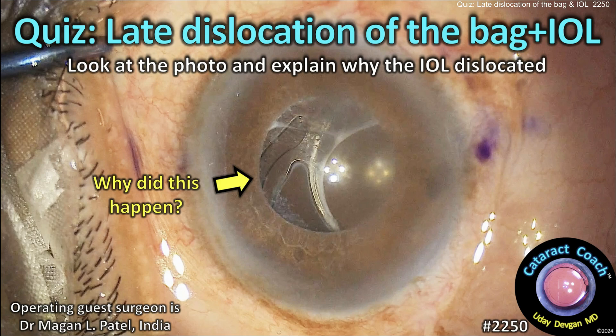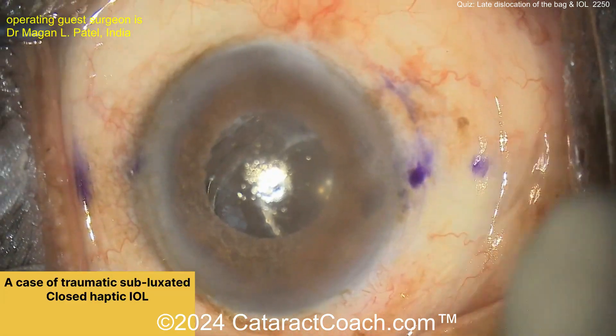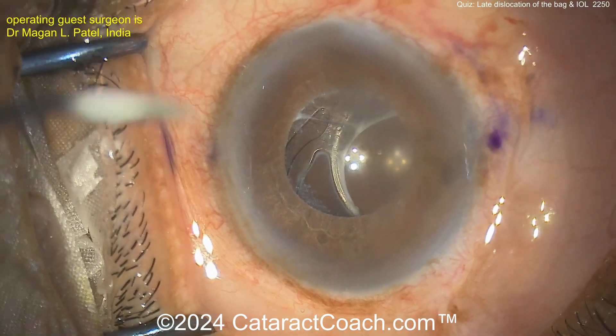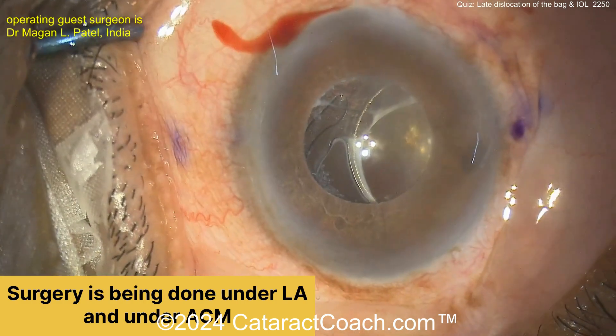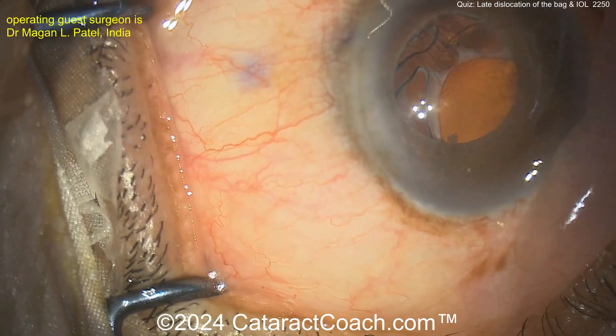cataractcoach.com cataract quiz — late dislocation of the bag-and-IOL complex. Look at that photo and tell me why this happened. Look carefully — is it traumatic? But there's something else going on too. Look at the pupil margin. What's all the white stuff? It's pseudoexfoliation.